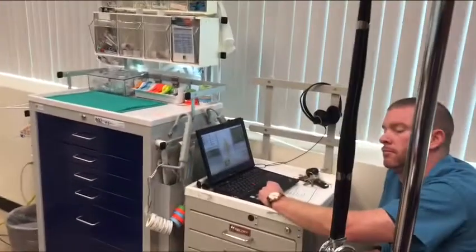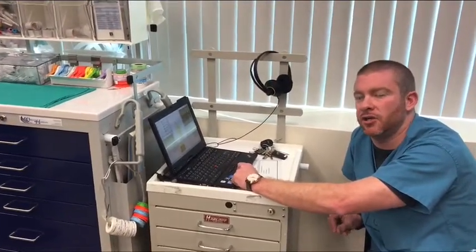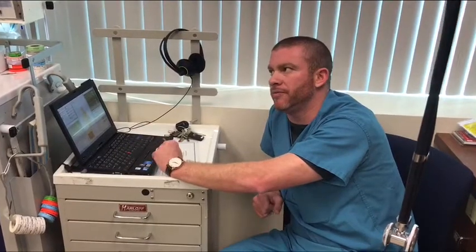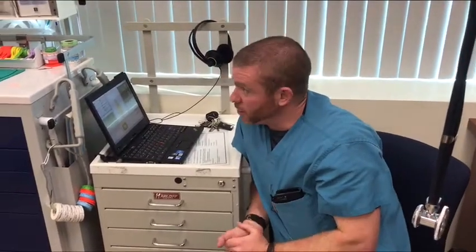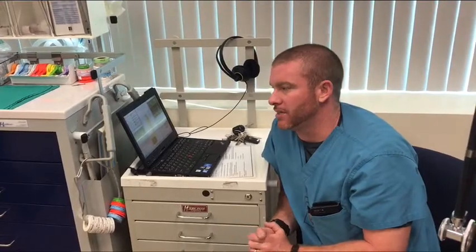So I give 50 of rock, and I gave my fentanyl, and I can tell the doctor you can make incision. You have gas on, we'll say 1.3 MAC. That's fine. You gave some narcotics, so that should blunt some of the incisional pain for the little incision. Thank God Garl was here to save you. Phone a friend, good job. That muscle relaxant was key, right? So we have muscle relaxant on board.